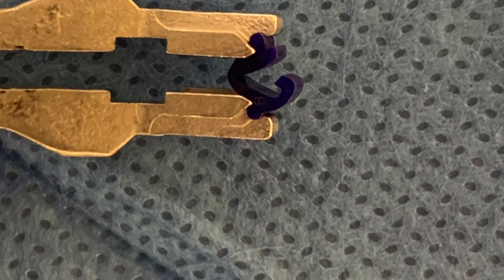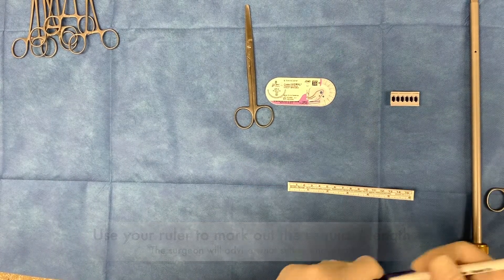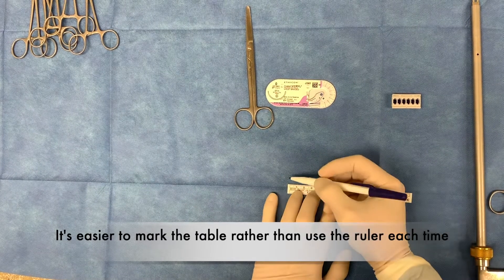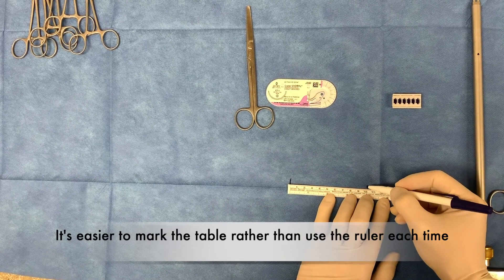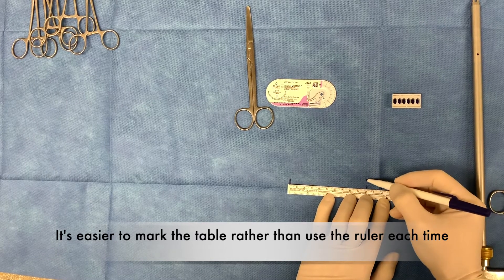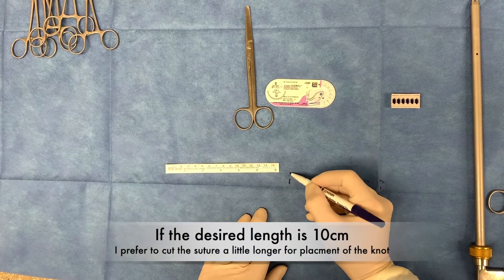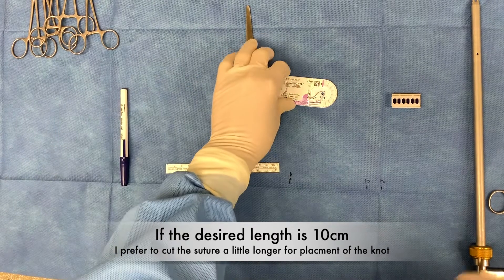The person will advise you as to what length suture they require. Simply take the ruler and mark out the lengths on your table. This will actually prevent you from having to use the ruler each time to mark your suture. If the desired length of the suture is 10 centimeters, then I simply like to cut the suture a little bit longer in order to make space for the knot when I'm tying it.